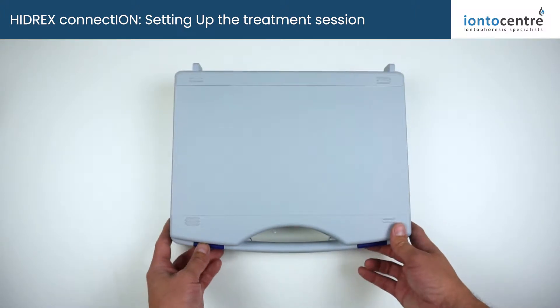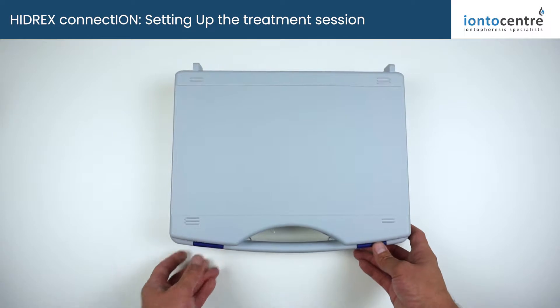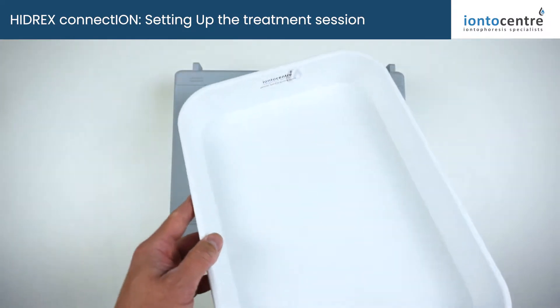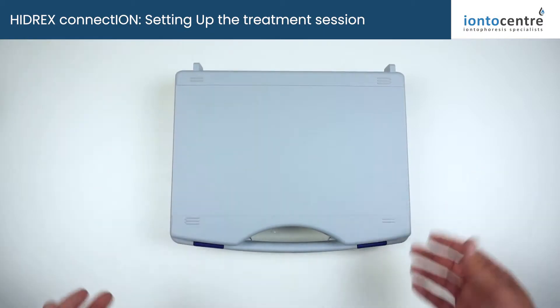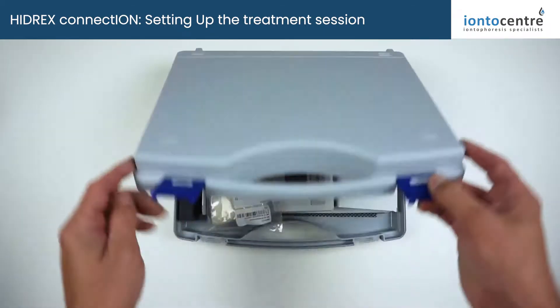Your pack will arrive in the standard carry case. This carry case also doubles as treatment trays. However, at Ianto Centre we also provide standard treatment trays free of charge with every order, just to save you having to use the carry case for your treatments, because it becomes a little bit awkward when you have to dry the case out to store your goods back in.